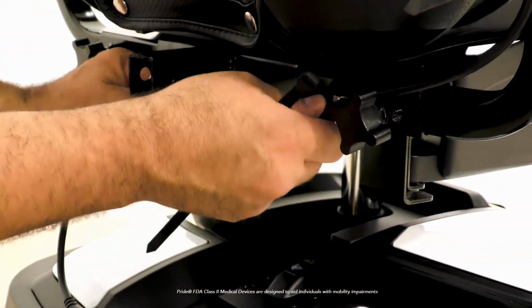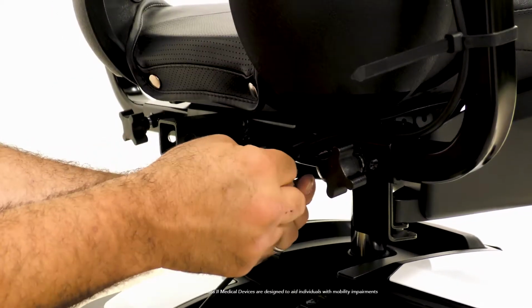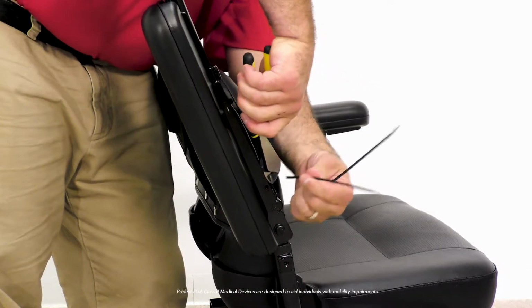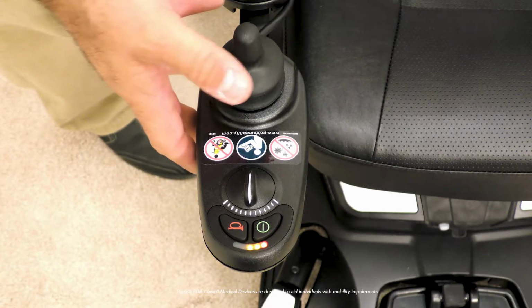Always orient the armrest upwards to ensure that there will be enough slack in the harness, and finish securing the harness to the armrest. Cut the excess wire ties flush so that there is no chance of the consumer getting scratched. Turn the unit on and test it to make sure it works properly.